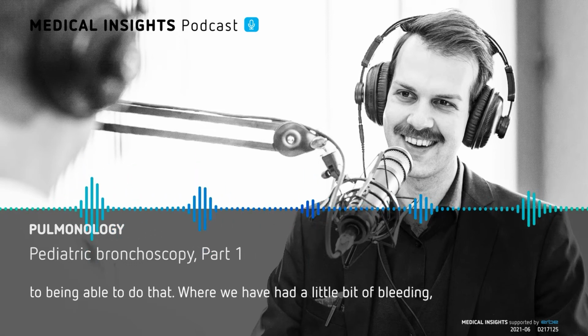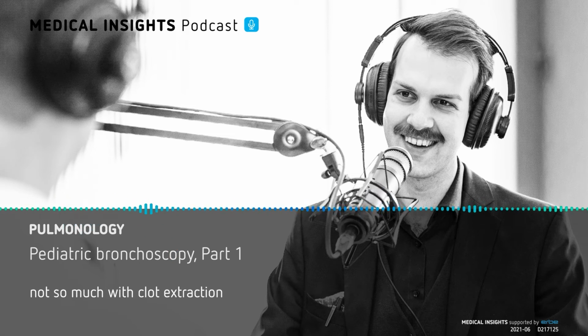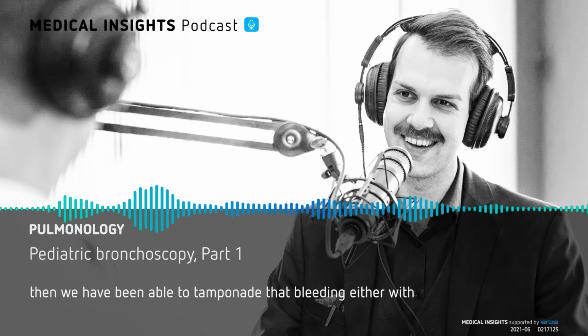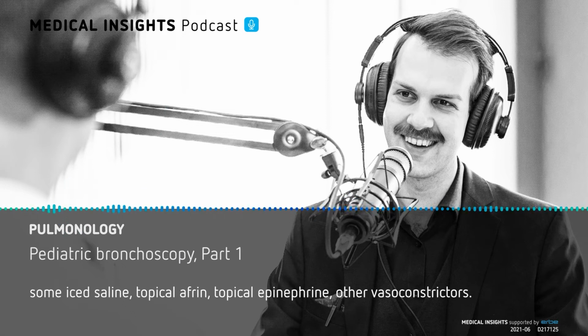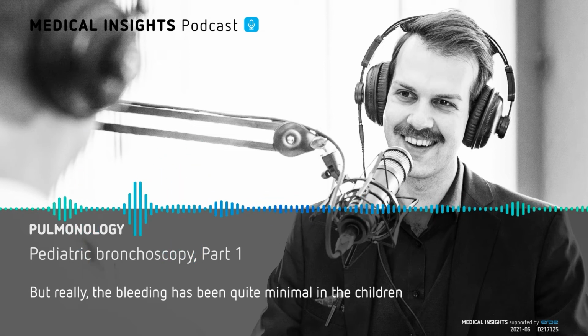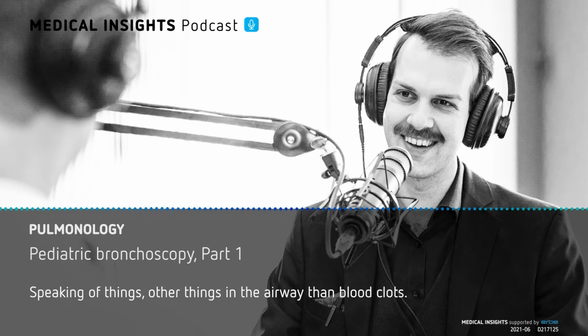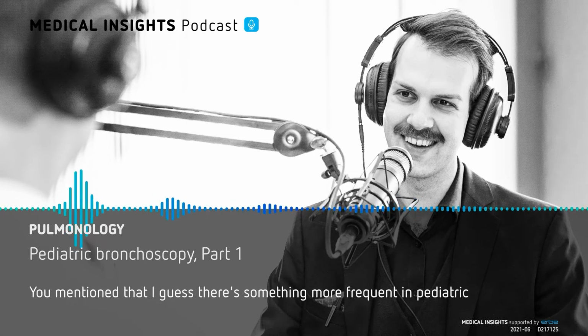Where we have had a little bit of bleeding, not so much with clot extraction or with mucus plug extraction, but say other mass extractions, then we have been able to tamponade that bleeding either with some saline, topical Afrin, topical epi, other vasoconstrictors. But really the bleeding has been quite minimal in the children that we've been doing endobronchial work with using cryotherapy.